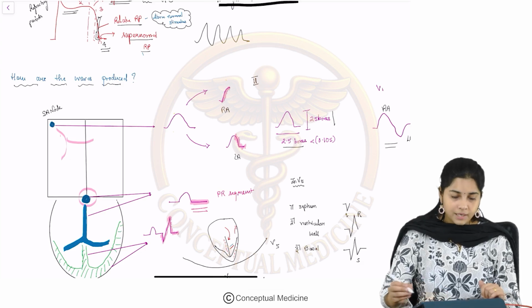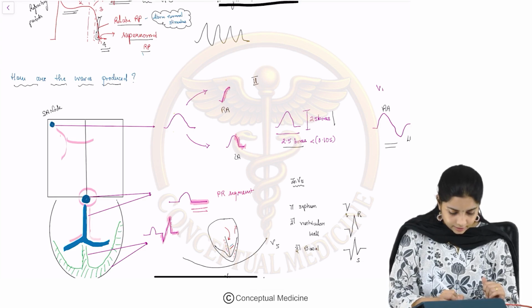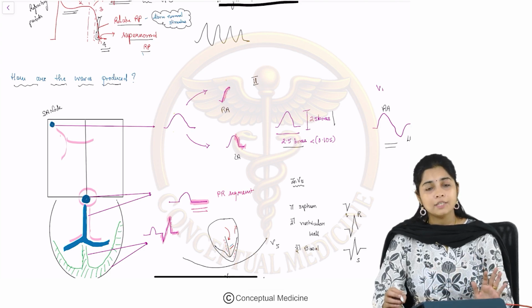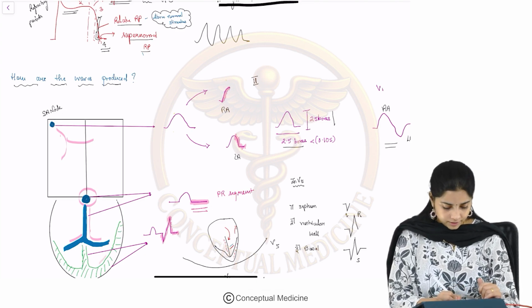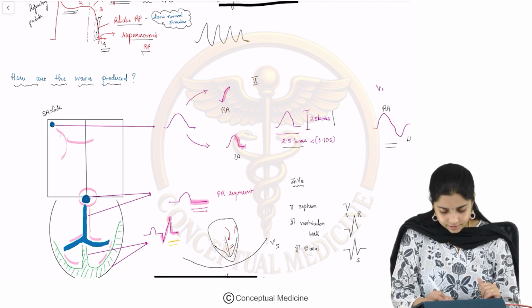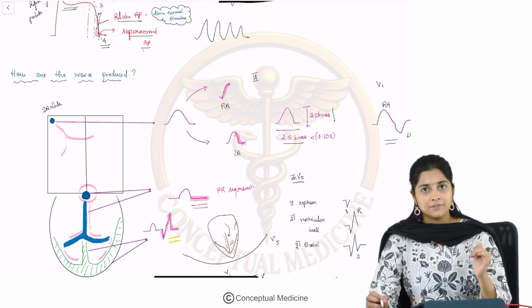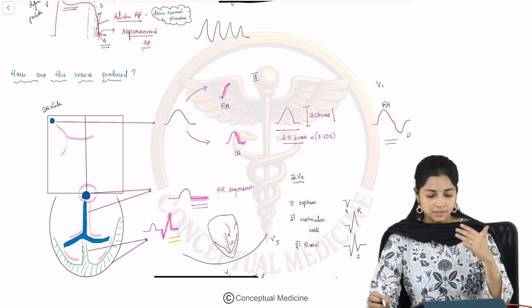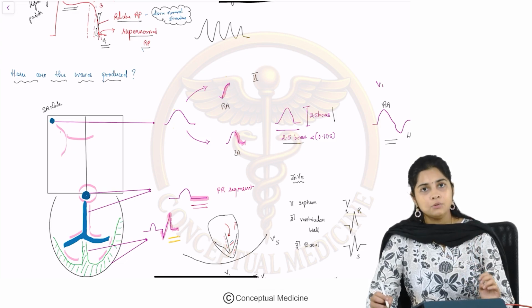Fine. Now, following the AV node, there is conduction down the bundle of His and the right and left bundle branches. Even conduction down the bundle of His is again recorded only as the PR segment, followed by activation of the ventricles. The activation of the ventricles is what results in the next complex, which is the QRS complex. So, understood till here? The right atrium and left atrium give the upstroke and downstroke of the P wave. Then the rest is the PR segment, where they remain isoelectric at the AV node and bundle of His. Activation of the ventricles is brought about as the QRS complex.